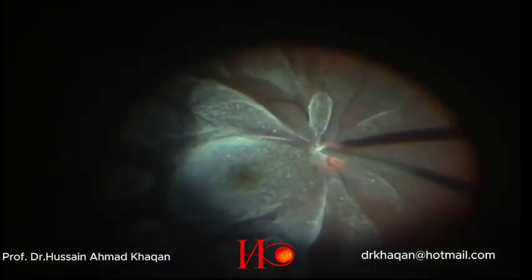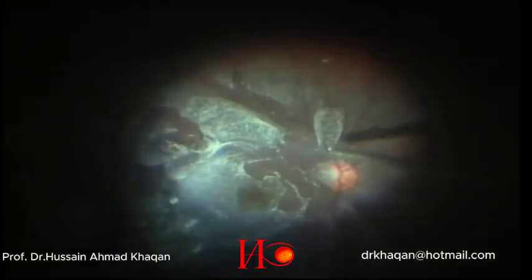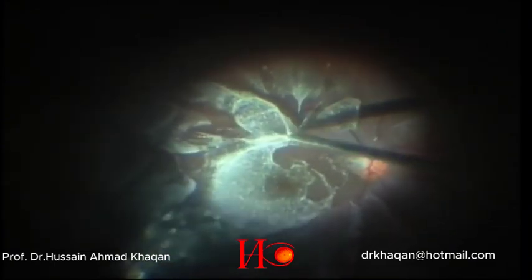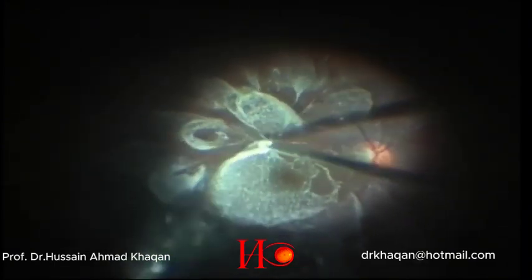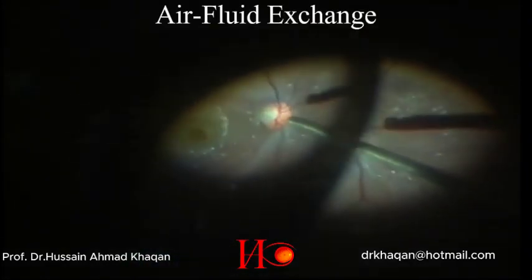I am trying to detach the posterior hyaloid, but it is a bit difficult. I tried to detach as much posterior hyaloid as possible, and then did the air-fluid exchange.